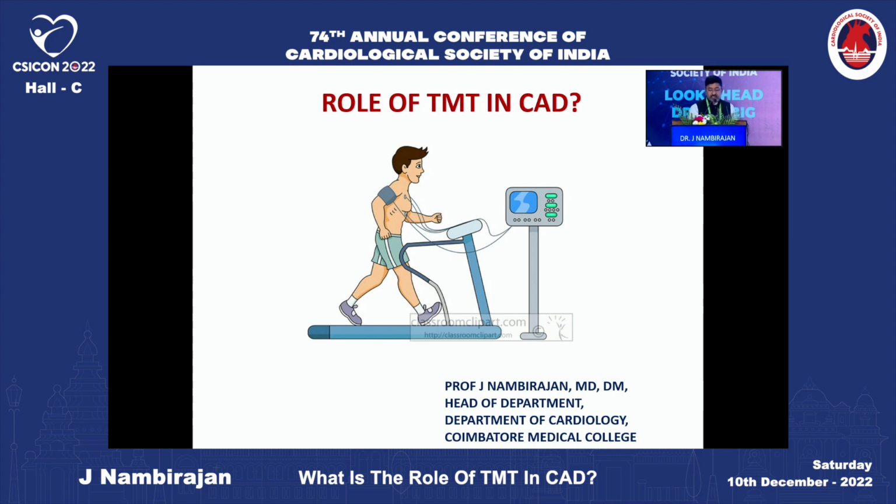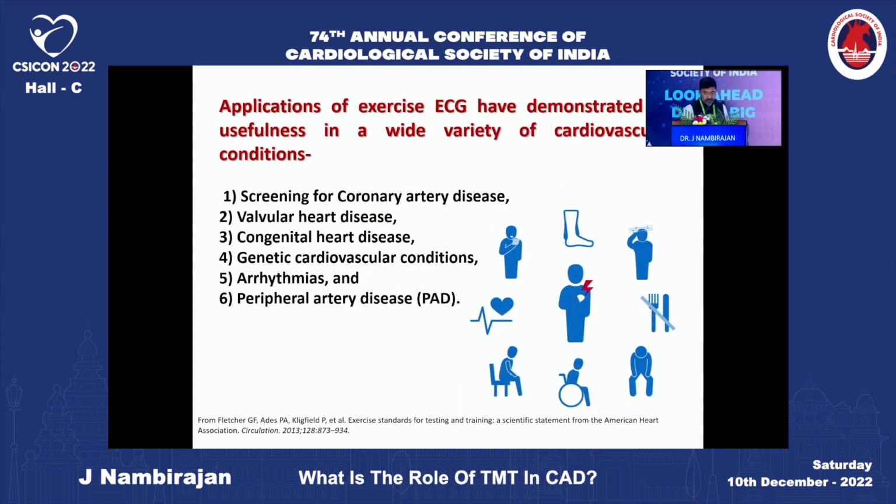Today, I'll be discussing the role of TMT in CAD. Though with the advent of a lot of newer imaging modalities, both physiological and other various methods, its role is a little bit questionable. Given this short time, I'll try to make the justification.